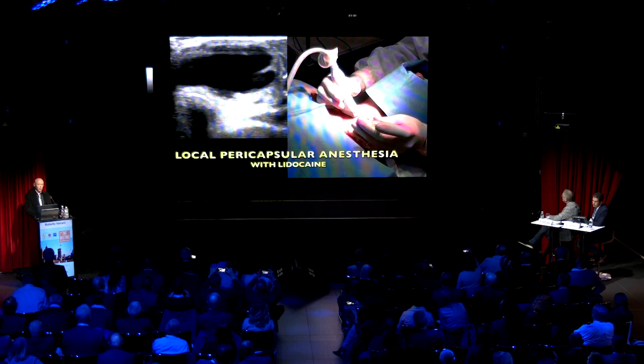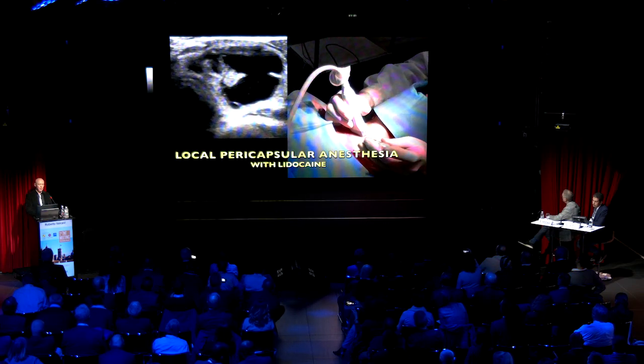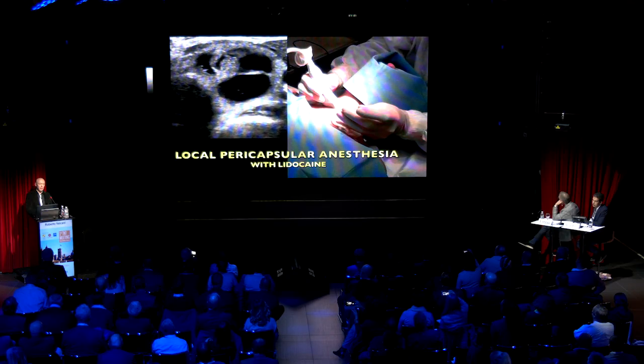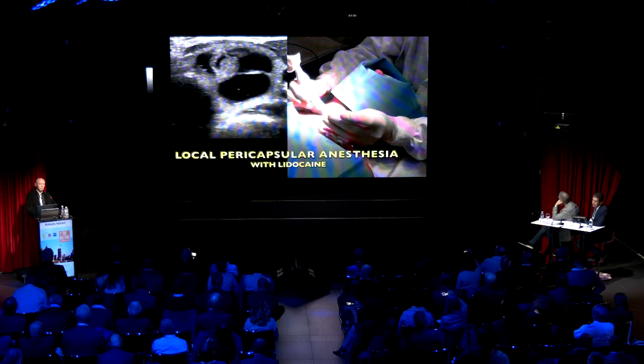A thin 27 gauge needle is then inserted exactly where Gilles said, between the capsule and the fascia, and just a few drops of local anesthetic are given.